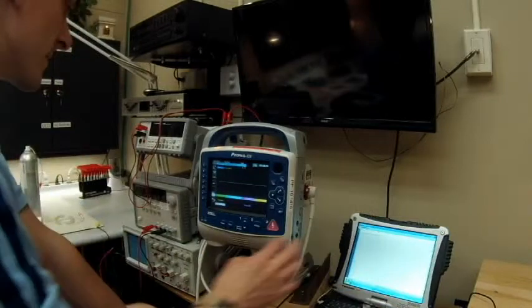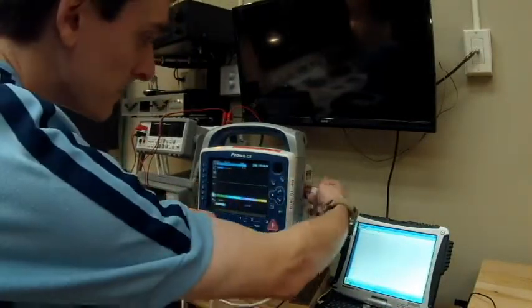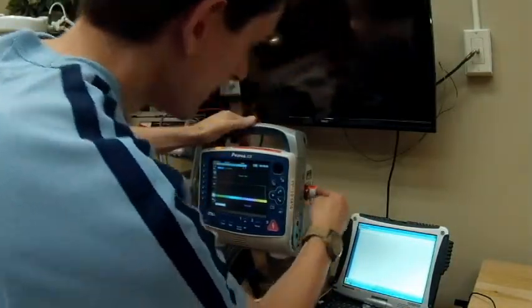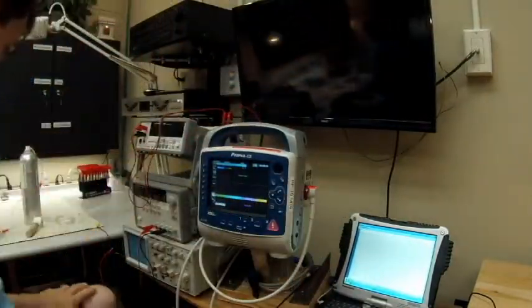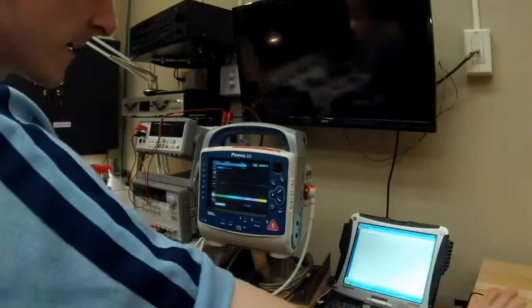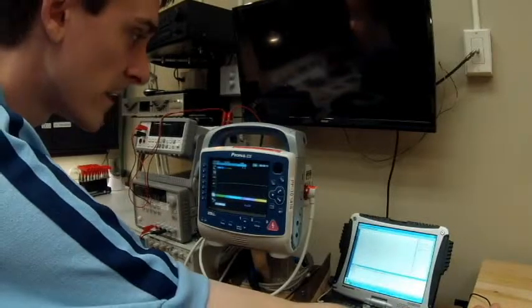Now we're doing the pacer test. I have two different leads — this one's pacer and this one's defib only. I don't feel like switching them out all the time, so we'll switch to pacer. We're going to hit next, and the pacer test is one of the easiest ones.